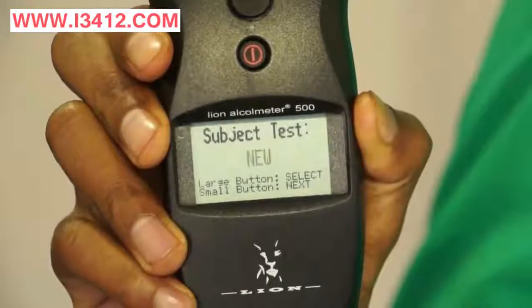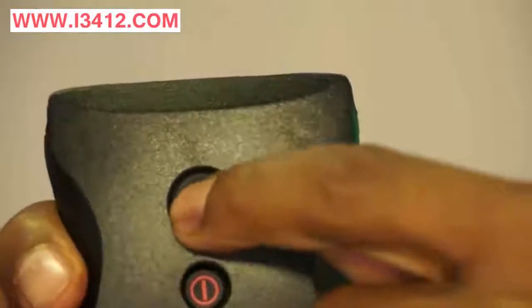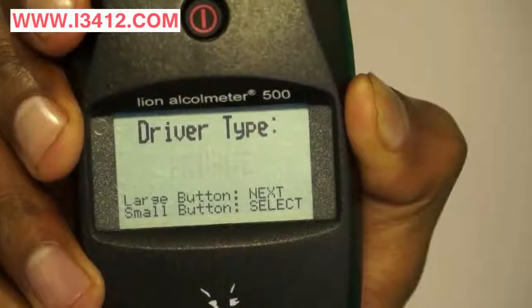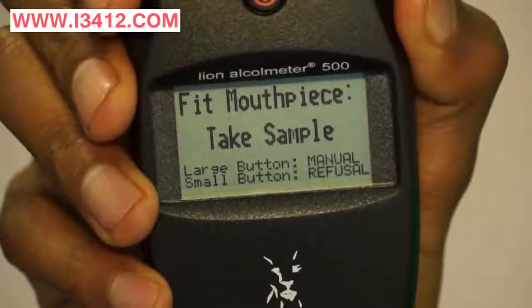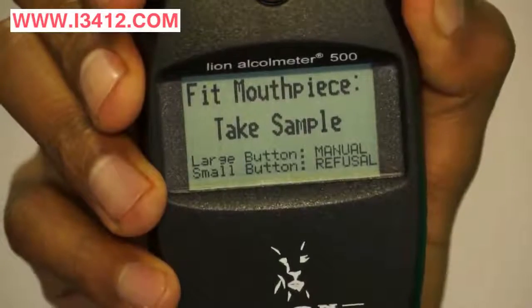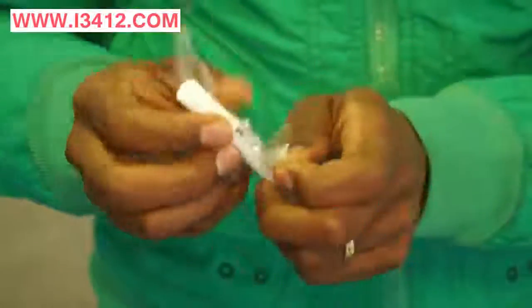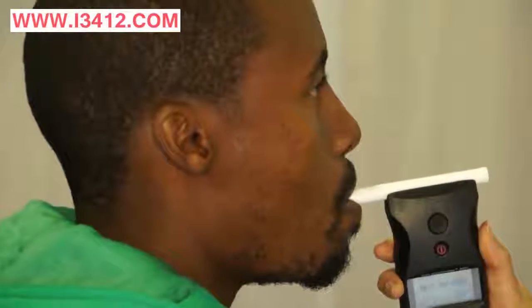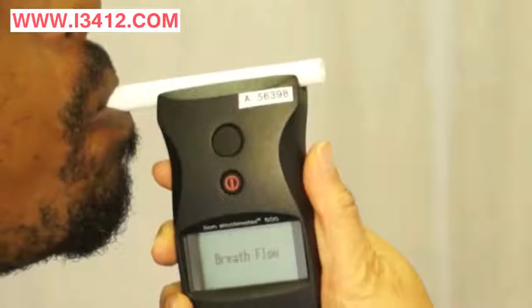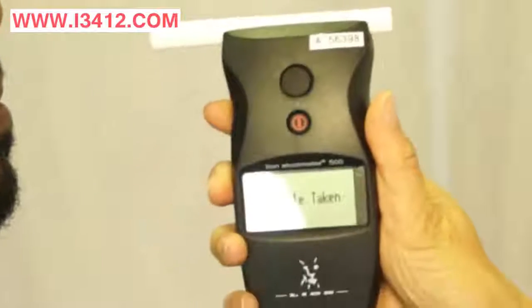Select to do a new test by pushing the large black button. The A500 RSA will ask you what driver type you want to test. If you are using the standard A500P, then it will go straight into the test mode. Unwrap and fit a new mouthpiece on. Instruct the test subject to take a deep breath and blow into the mouthpiece. The instrument will measure the volume of air and sample automatically once there is sufficient breath flow.